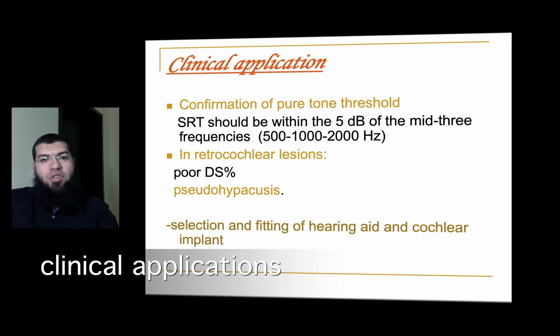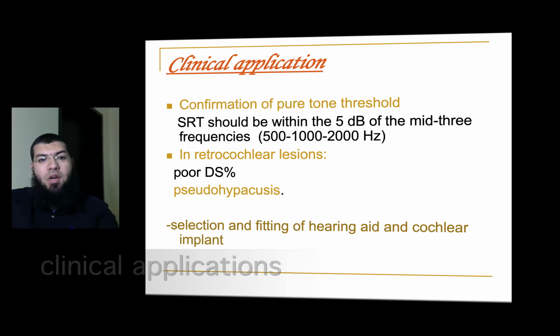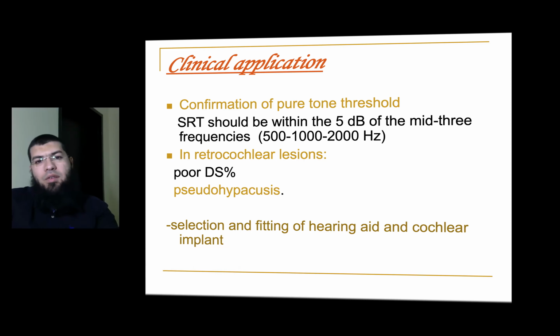The clinical application of speech audiometry is for confirmation of the pure tone test. The SRT should be within 5 decibels of the mid-3 frequencies. In retrocochlear lesion, it gives poor speech discrimination.